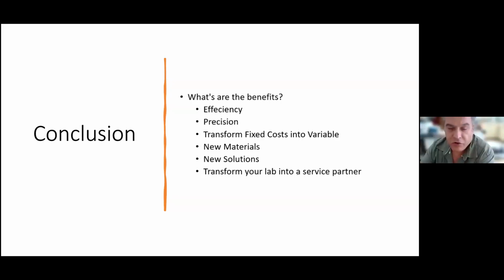What will you do with new materials if you stay in the analogue way? How do you want to do zirconia? How do you want to do nano hybrid composites? It's not possible by hand, not possible. New solutions will be out there. We have face scanners. We can do implant planning. We can show the patient, this is what you get when you work with me. And so you can print, for example, a setup model, and you can show it to the patient. This is your smile in 2 weeks.